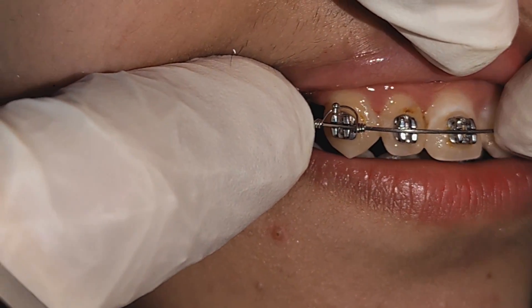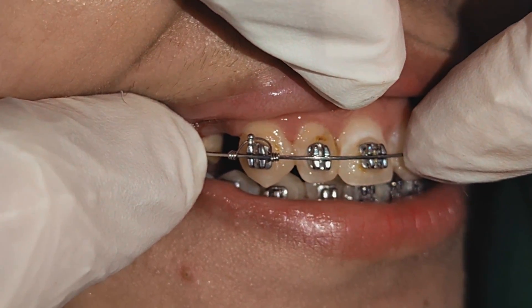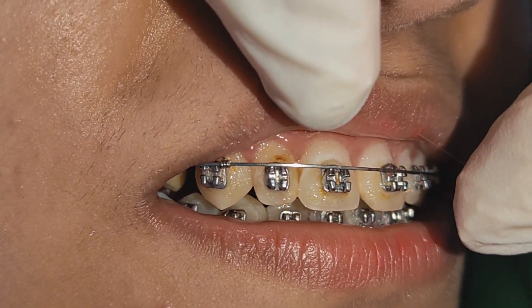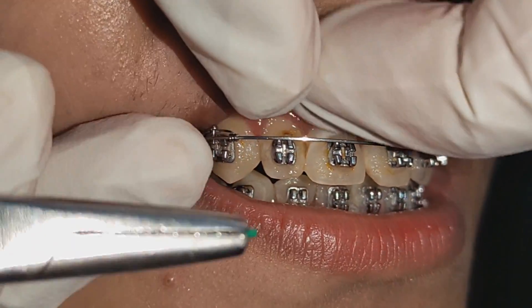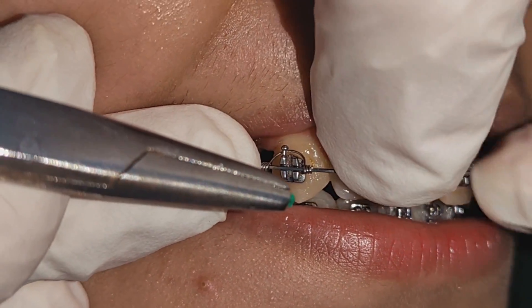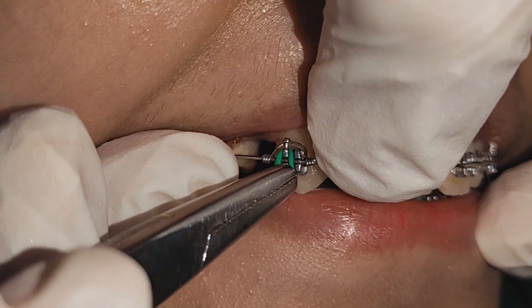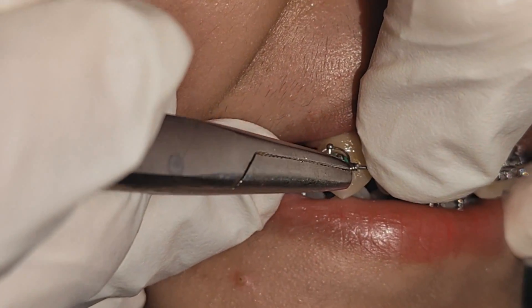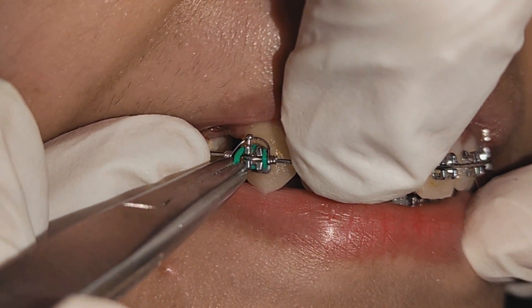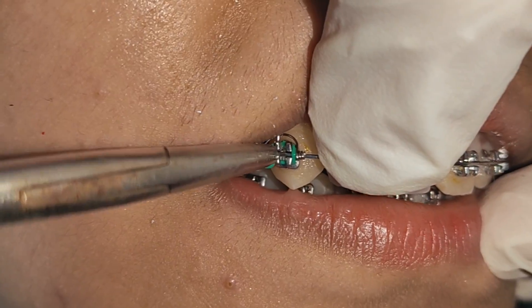All you need after that is to stabilize the wire with your finger, because there is a force from the spring that will pull the wire out of the bracket slots. So you need to stabilize the wire with your finger and then start securing the wire in the bracket slot of the canine using elastic ties or metal ligature ties.